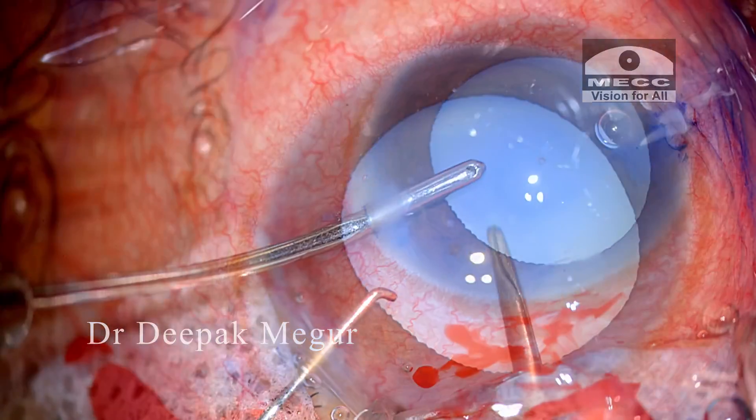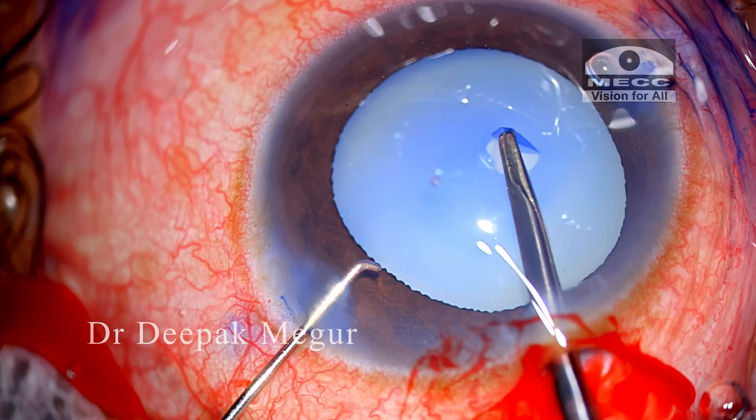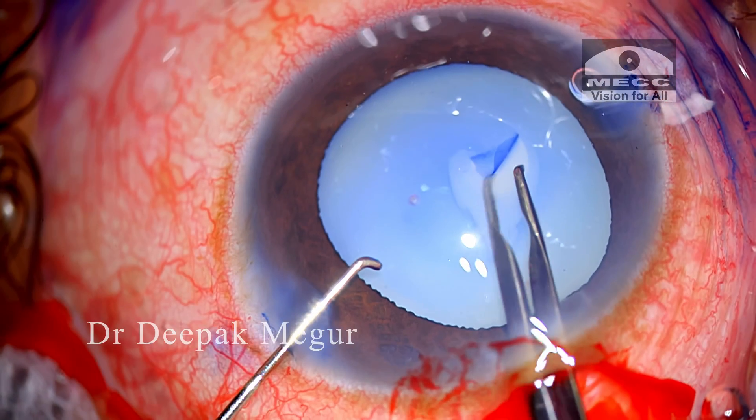The visibility is not great, and as soon as I puncture the anterior capsule, the fluid cortex leaks out.